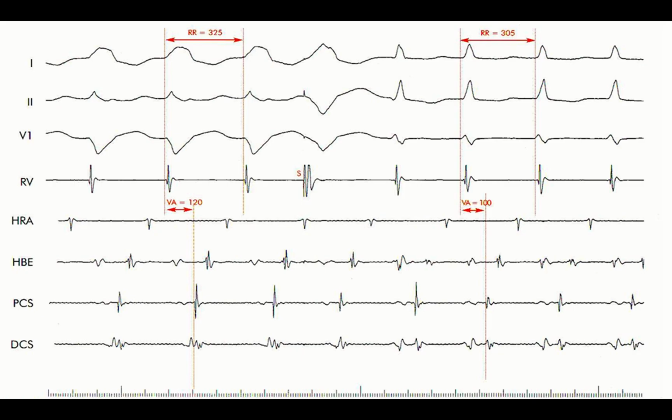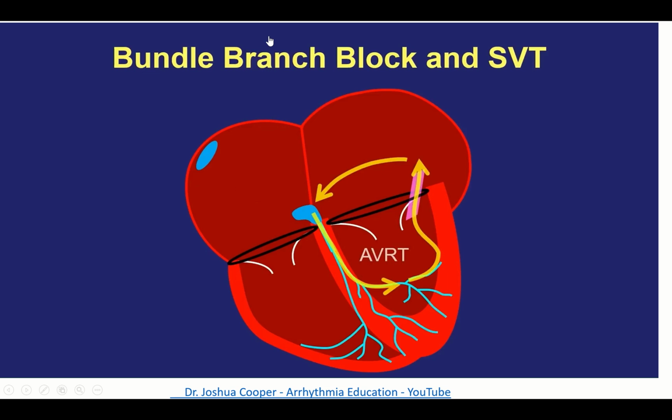Now let's go to the sixth point: when you induce tachycardia of AVRT and assess the features of tachycardia. On the right side we have narrow complex tachycardia, and the VA interval is 100 milliseconds, so it is not a case of AVNRT. Tachycardia cycle length 305. On the left side, the patient developed wide complex, left bundle morphology. During this, the VA time increased to 120 milliseconds. The cycle length increased to 325. So we are dealing with a case of AVRT using a left lateral accessory pathway.